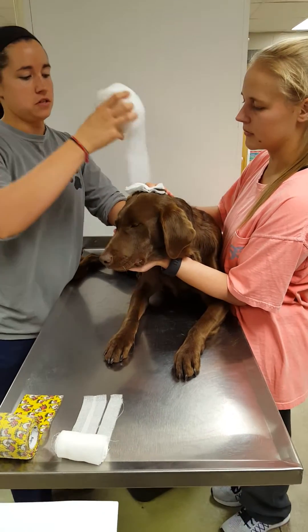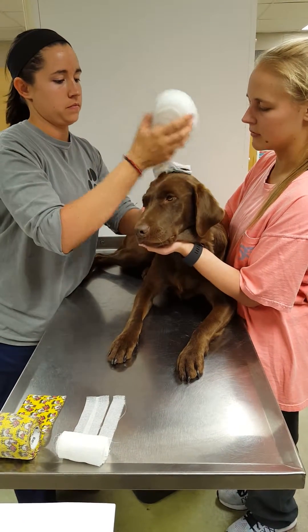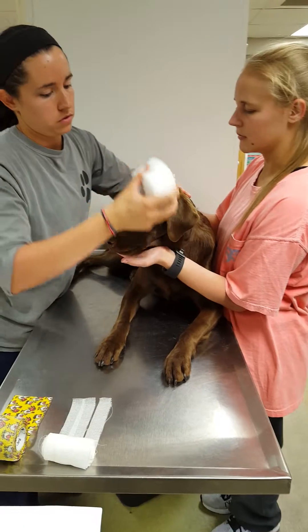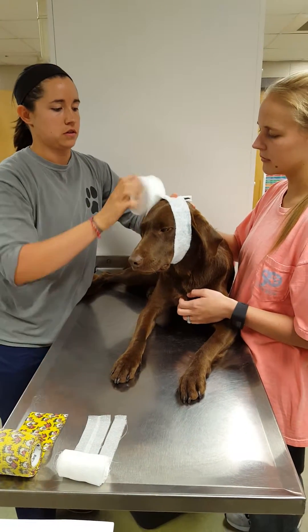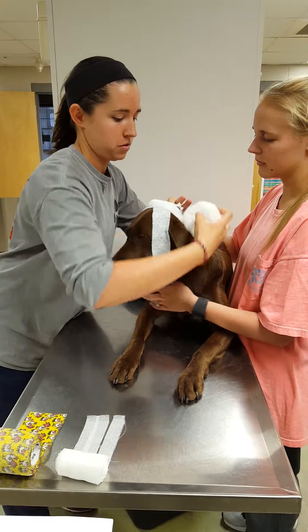I'll take my cast bandage and start at the top and roll it around in the front of the ear, and then all the way back and come on the other side of the ear.